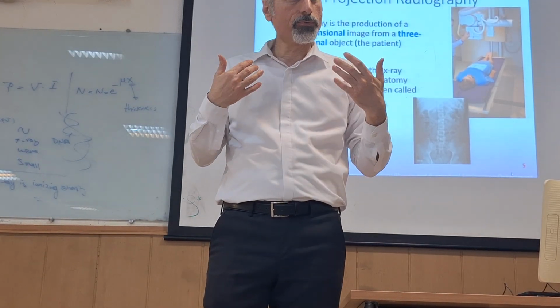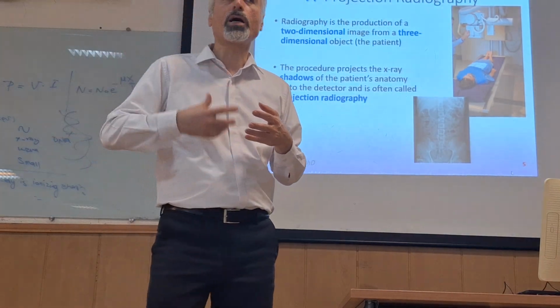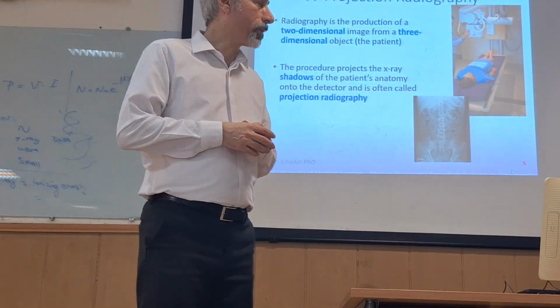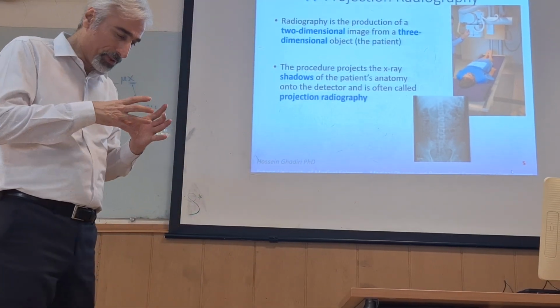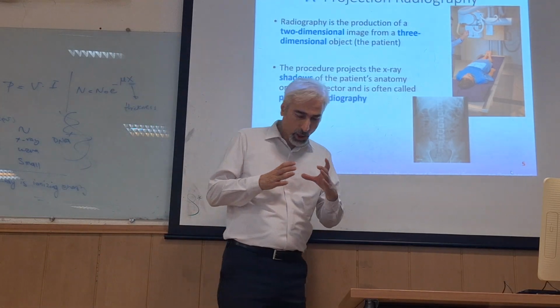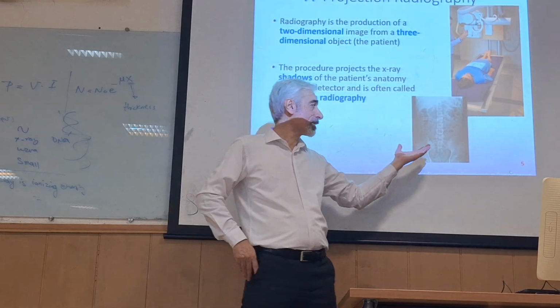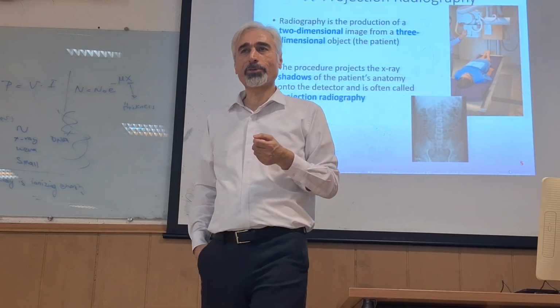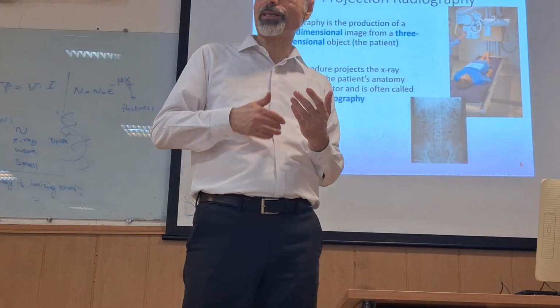Minimize because we should intend to minimize the X-ray photons that go through the patient because it's harmful, and very precise, because if you cannot precisely locate the position of X-ray, after seeing the image maybe you find out that this is a wrong place, and you should repeat the scanning.